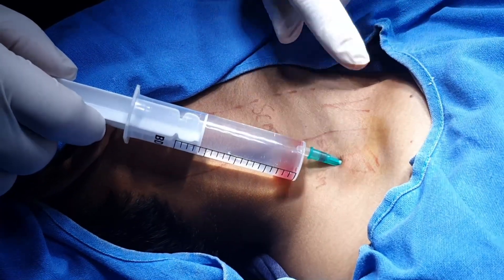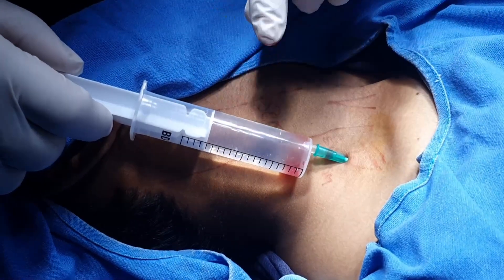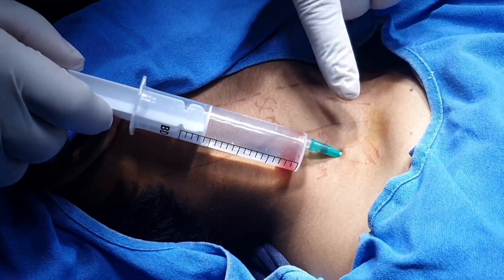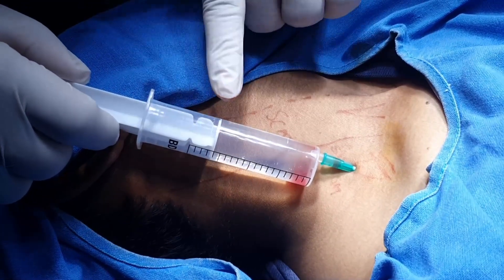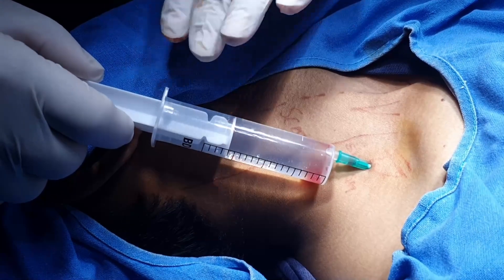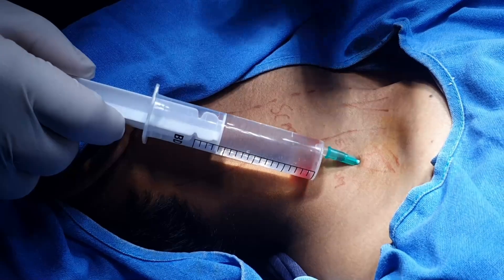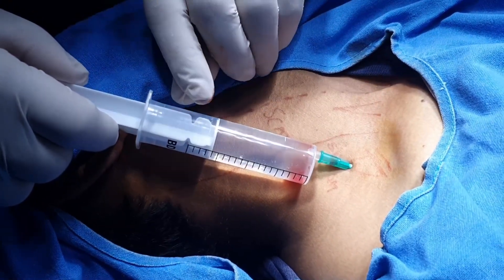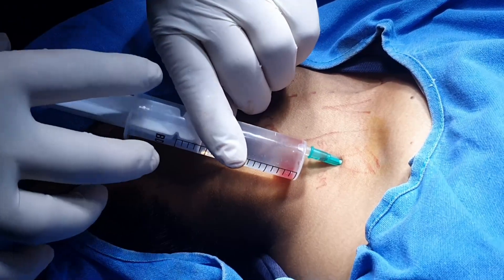Be very slow — either if you draw back the syringe or move further down, wait for some time and check there should not be any blood in the aspirate. This is the way to avoid accidental intravascular injection. If there is accidental injection you may notice a sudden rise in pulse because of adrenaline in the solution. So stabilize it and check it.